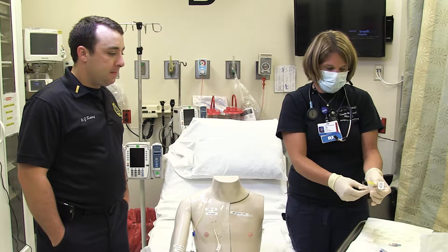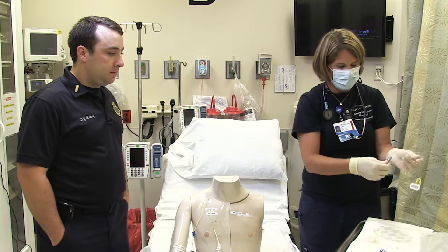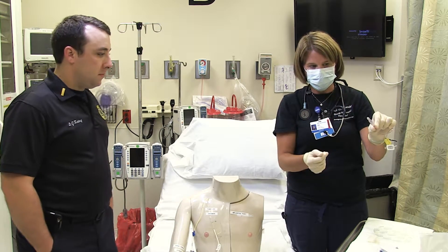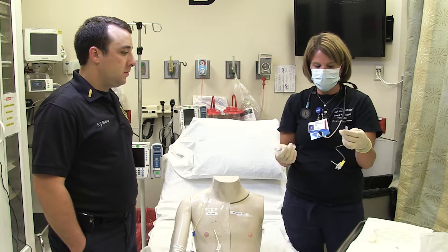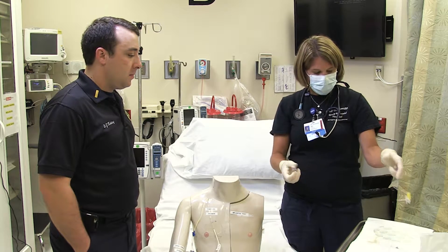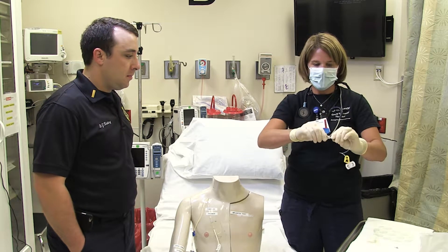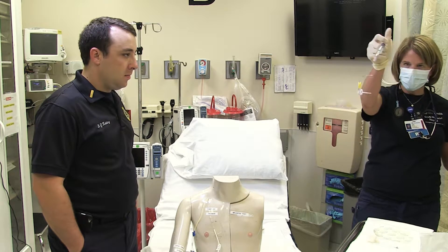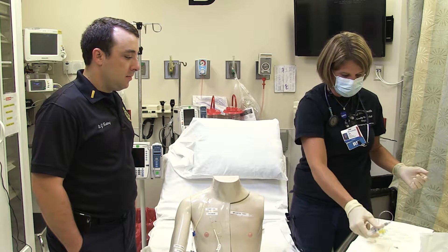What you're going to do is pick up your port — this little end is just going to twist off — and this twists onto that, making it a needless system. Then what you always need to do — this is super important — you have to flush it before you access, because you would give a patient an air embolus if you didn't. So you go ahead and flush it, kind of letting it sit until it's squirting out, and then you're all the way flushed through.